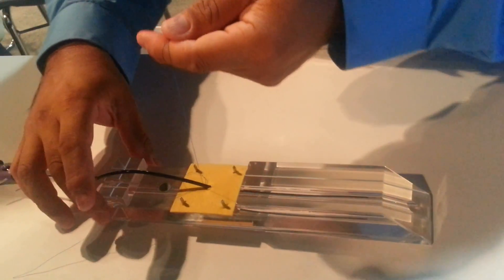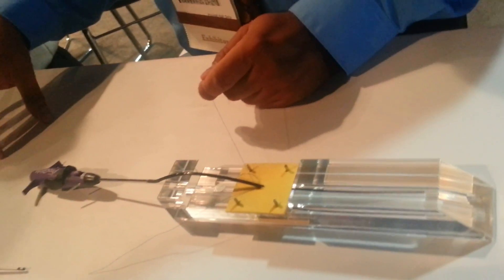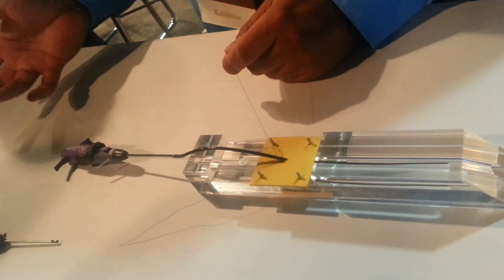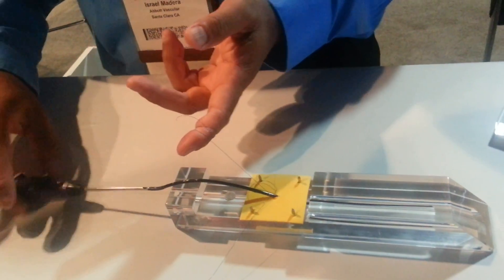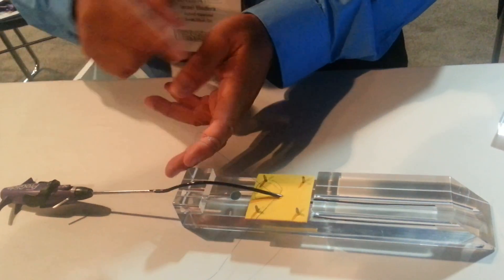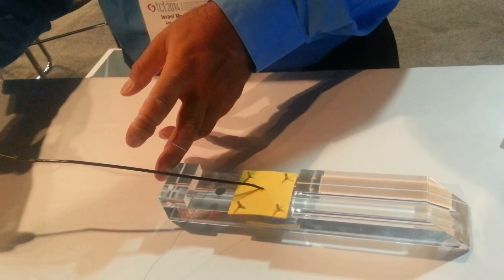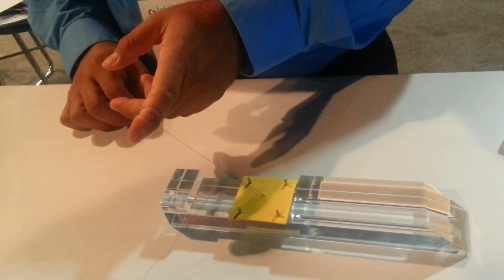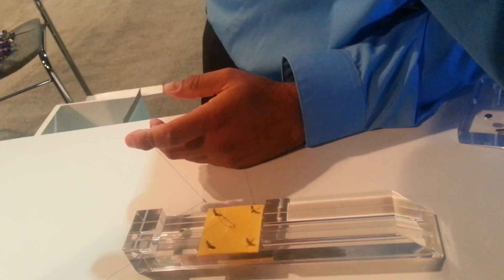I'm going to take the non-rail — sorry, the rail. The rail is the longest one and it's all blue. Non-rail is short and it's white. We tell everybody white makes it tight — that's the easiest way to remember. The knot is here, and as I'm pulling this, all I'm doing is moving the knot down. As you can see, the device is out. Pull — only the blue.